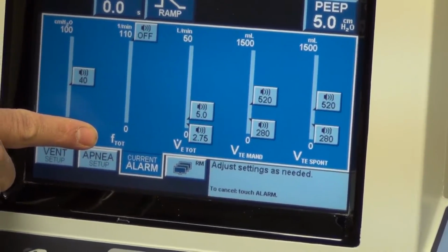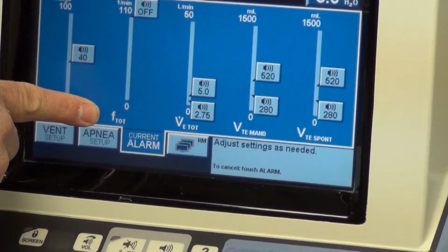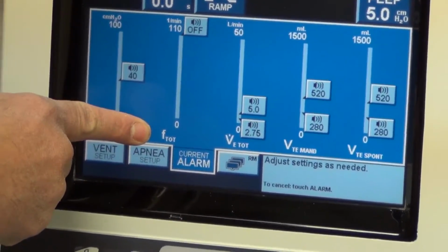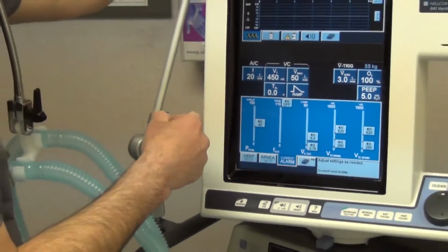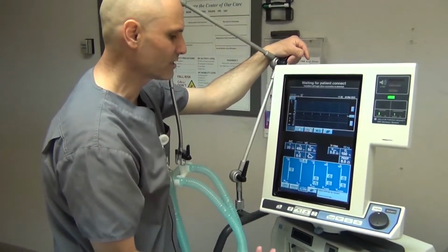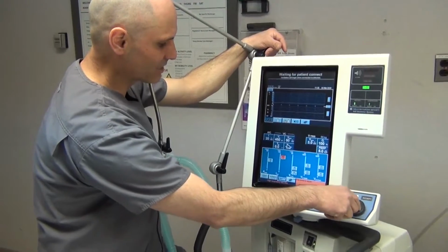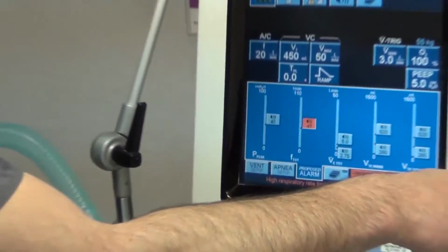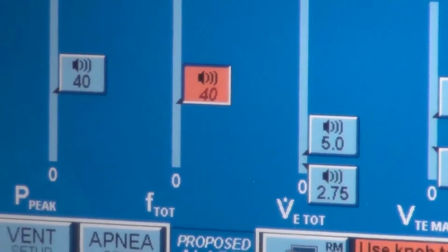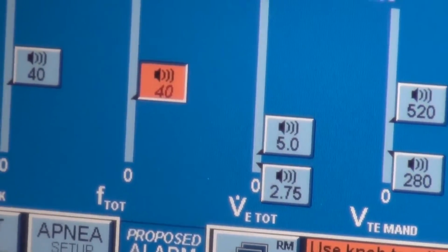The next one, next to it, is our total frequency. Normal respiratory rate is anywhere from 12 to 20. We know that our sick patients that have a fever will be breathing extra quickly, and we want to allow for that to happen. So frequently enough, our sick patients will be breathing 30 times a minute. So for intents and purposes of keeping it as simple as possible, we're going to set that to a respiratory rate of 40. So it allows the patient to breathe some extra breaths, but yet not to be breathing 50 times a minute where we know something is dramatically wrong. So 40 we'll set for now.